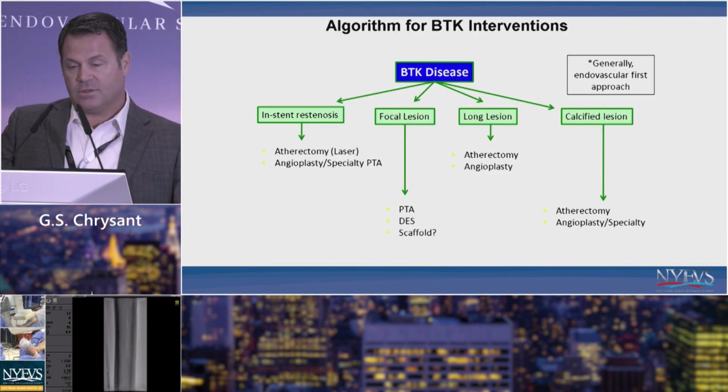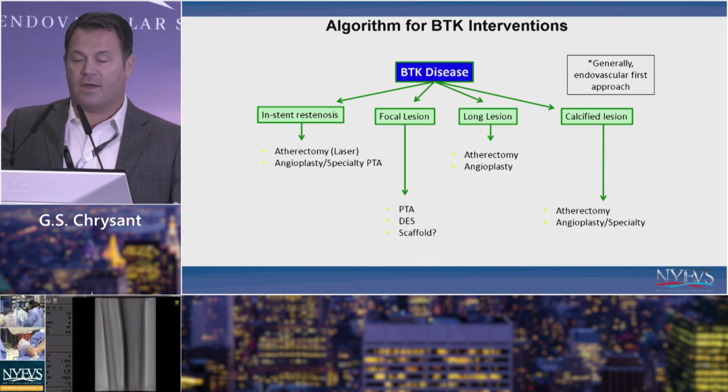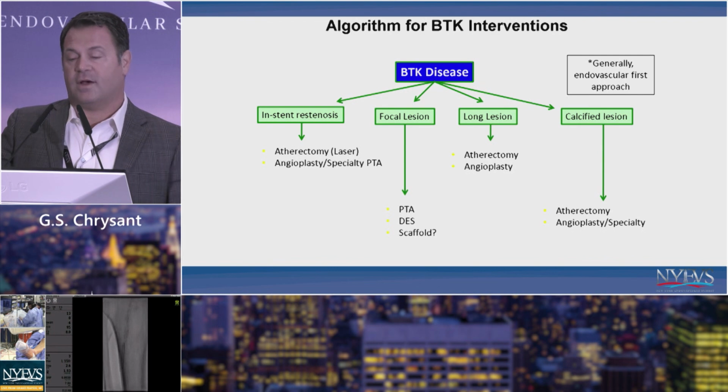So in closing, just my algorithm, I think it's got to be tailored, but again, keep in mind all of these different pieces of equipment. If you're dealing with ISR, you're probably going to deal with a different sort of atherectomy device than a long calcified lesion, and then focal lesions, you can probably do whatever you want.